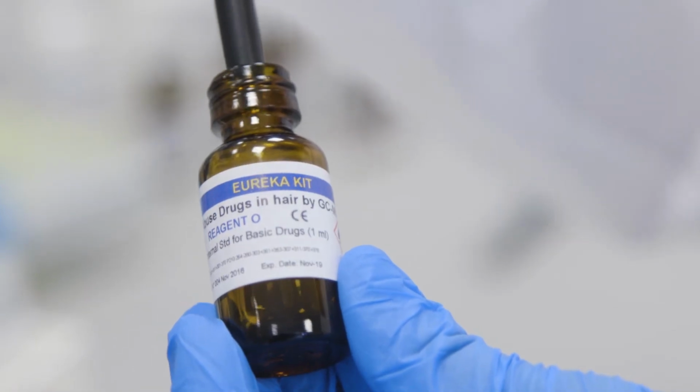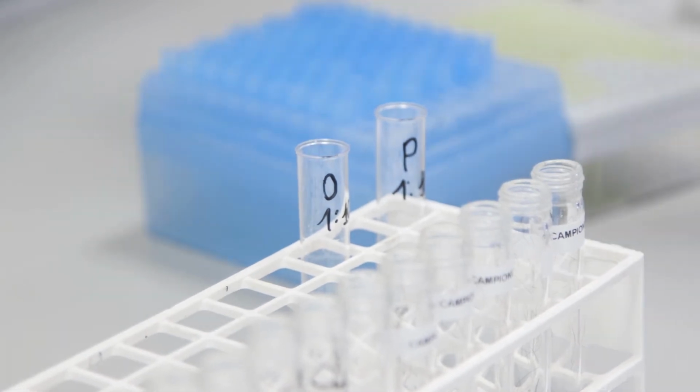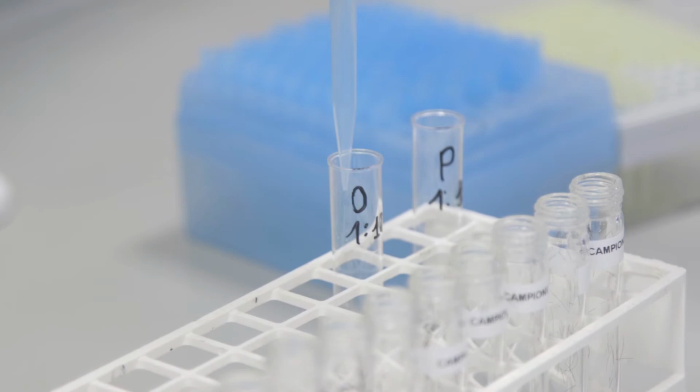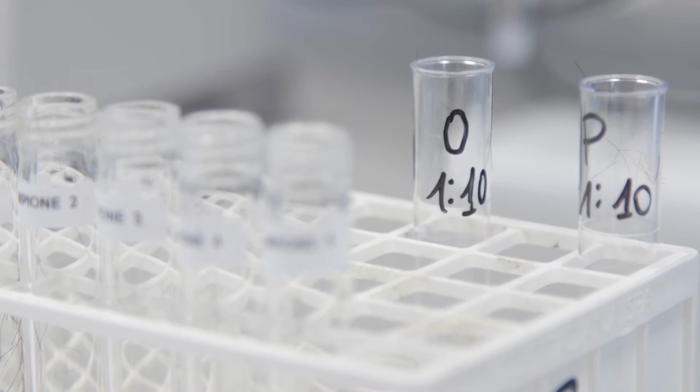In our analytical session with 5 unknown samples, 6 calibrators and 2 controls, it is necessary to prepare 25 microliters per 13 samples, namely 325 microliters of internal standard, reagent O diluted and reagent P diluted. Therefore, take 32.5 microliters of reagent O, internal standard for basic drugs, or 32.5 microliters of reagent P, internal standard for amphetamines, and dilute with 292.5 microliters of H2O, respectively, in 2 glass test tubes.